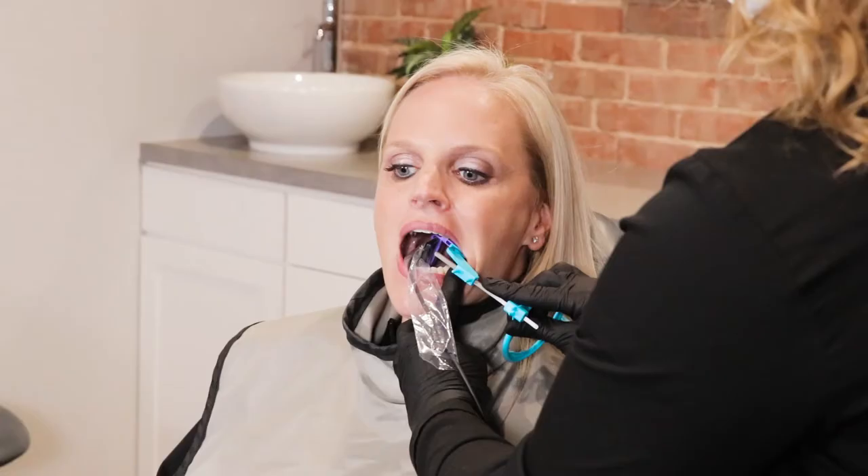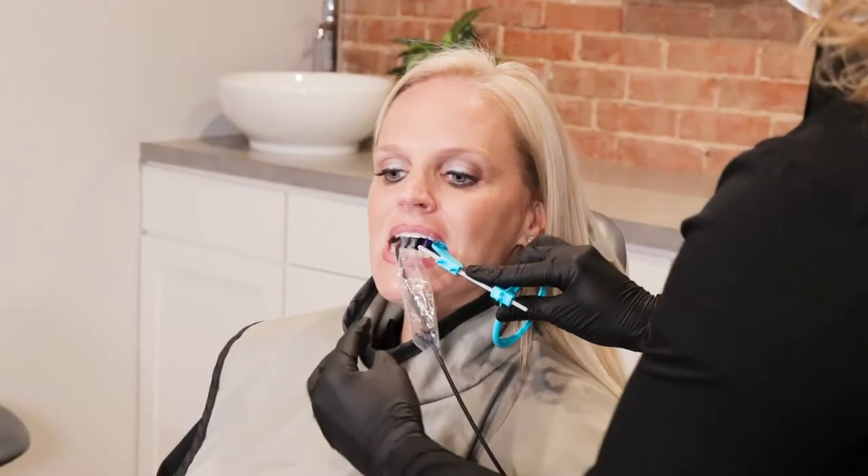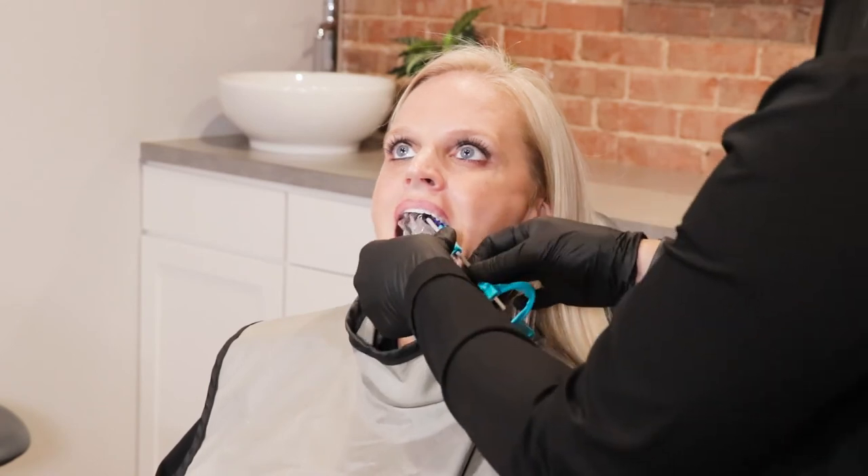For the lower posterior PA, retract the patient's cheek for increased visibility into the mouth. Place the sensor between the lingual side of the lower molars and tongue. Have the patient bite down. Make sure the ring is as close to the face as possible.